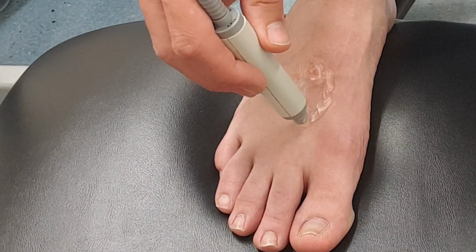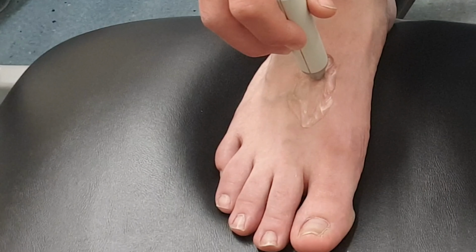And then once you get near to it, to find a better signal, just use very slight movements. So that's a really nice signal. So once again, for this one, it's between the first and second met, and you just draw backwards until you find it.